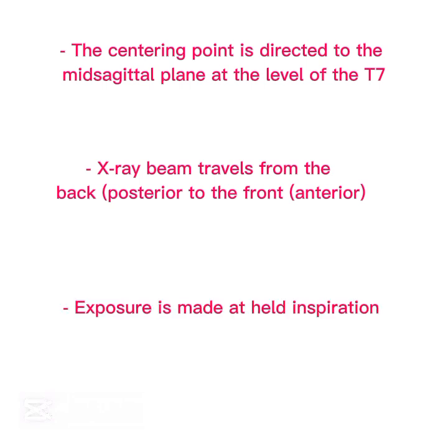Another important thing to note is that the exposure is made at full inspiration. That means you instruct the patient to breathe in. So as the patient breathes in, you tell the patient to hold the breath until you ask him or her to breathe out. So the patient will breathe in and hold his or her breath. That's when you will expose. After exposure, you can then instruct the patient to breathe out.